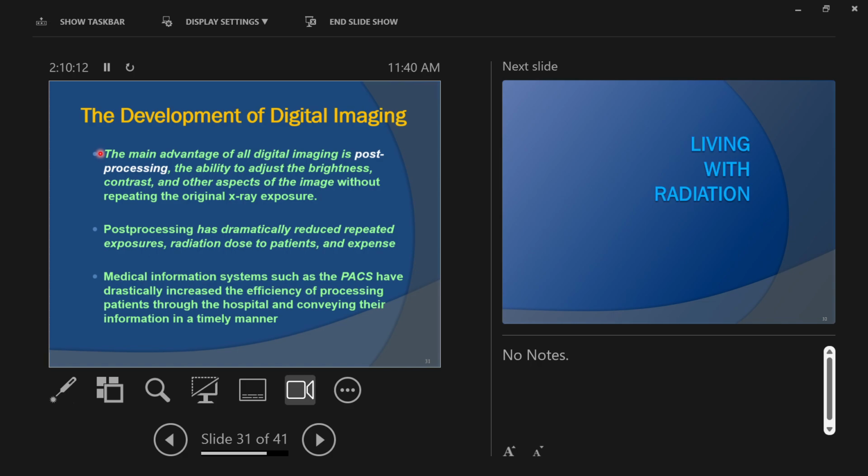I like how yours has the whole body part. Yeah, you can see the whole body and select, right? It's great. There's just a number of things we can do. We can adjust the brightness, the contrast, other aspects. We can crop the images, right? But you can't crop a lot though, right? You shouldn't. You can crop whatever you want, but you should not be cropping more than you need. That's sort of bad practice to crop more than you should.